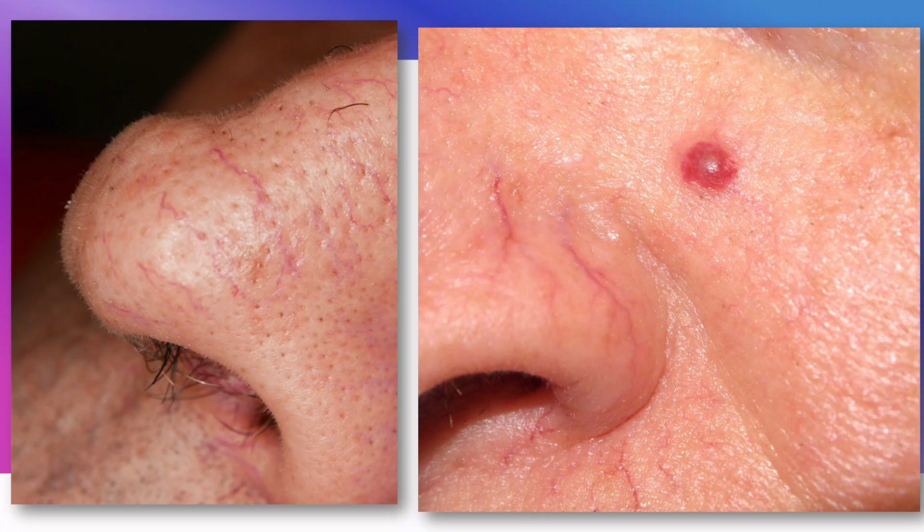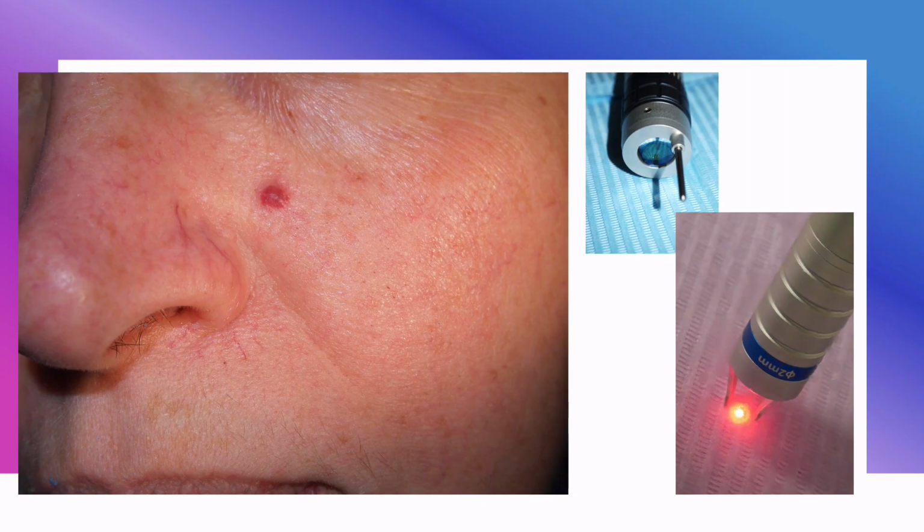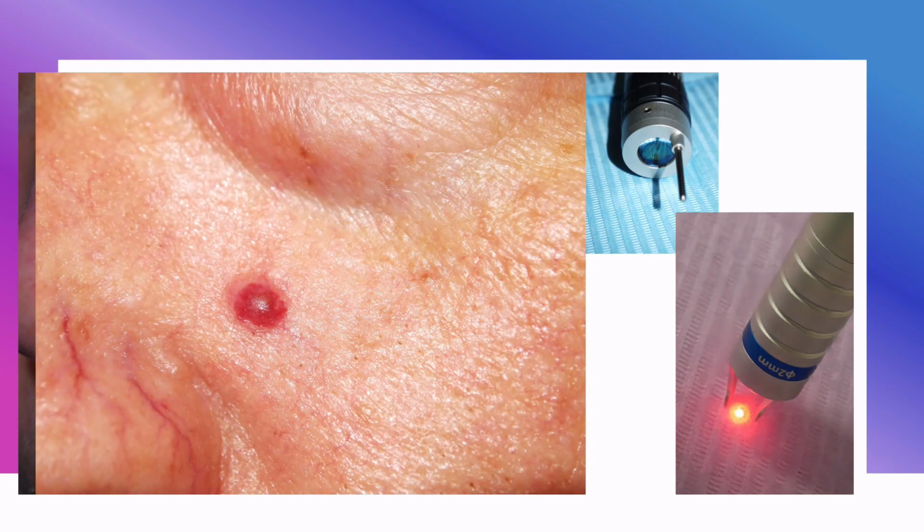Let's see how intraoral or extraoral low-flow vascular anomalies can be treated by means of diode laser in a non-invasive modality. In the present clinical situation, an extraoral vascular venous or capillary low-flow anomaly is situated between the nose left wing and the inferior orbital border. The maximum diameter of the lesion is 4 mm.